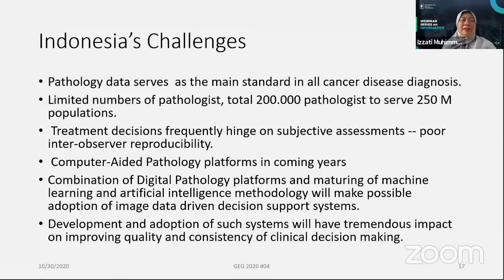So if we have, say, 100 slides, and we ask the pathologist to read them at one time, when he or she decides the grade of the cell, we have that information. And then we let her pause for, say, 3 weeks. Three weeks later, we ask her to read the same slides again.